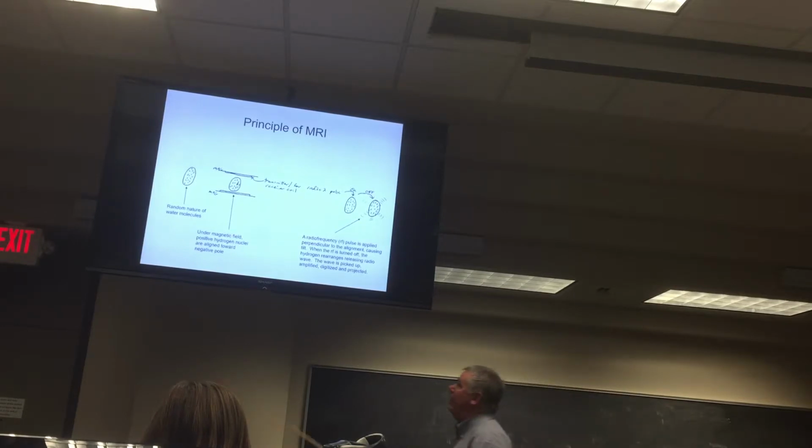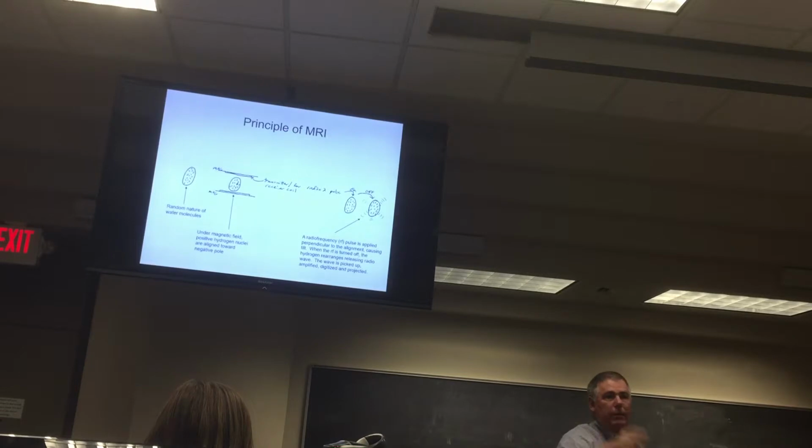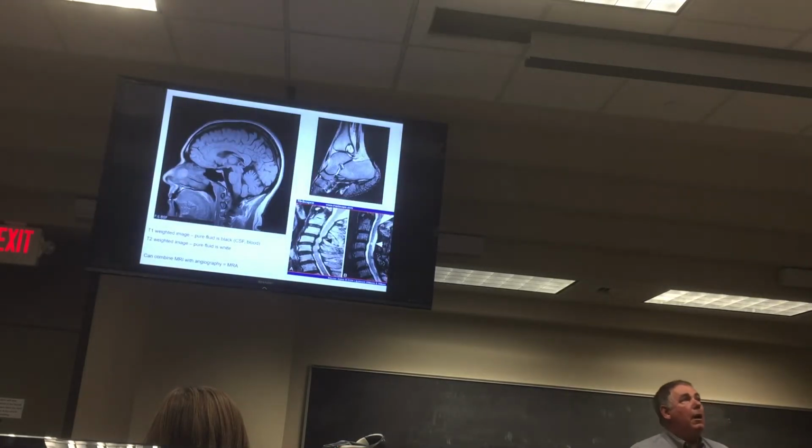So the way it works is water in your head, for example, is randomly positioned. The hydrogen nuclei in your head are just drowning in motion, all over the place. You're going to apply this magnet, and what it does is it lines up the hydrogen nuclei towards the different poles of the magnet. And then they blast from the side a radio frequency wave that jiggles those lined up parallel hydrogen nuclei off to the side, and then when you turn off the radio frequency, it bounces back. And when it bounces back, it releases energy. And it's the computer that picks up that energy release, and I'm simplifying this horrendously, but it picks up that energy release as a type of radio frequency and puts it into a digital format where you can see it. Okay? And they're beautiful.